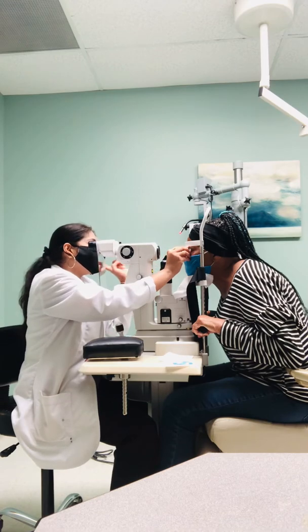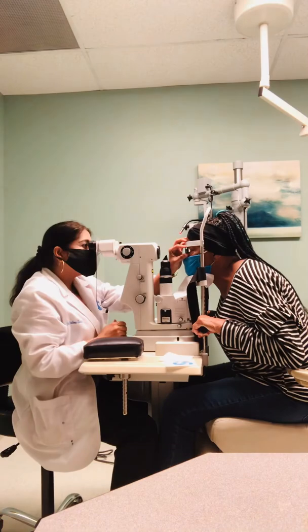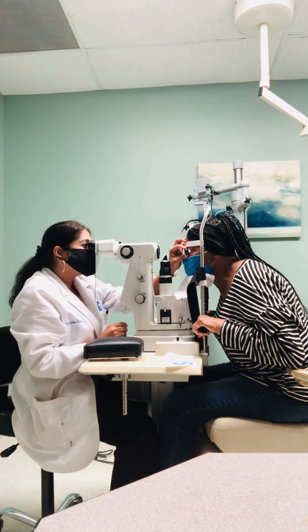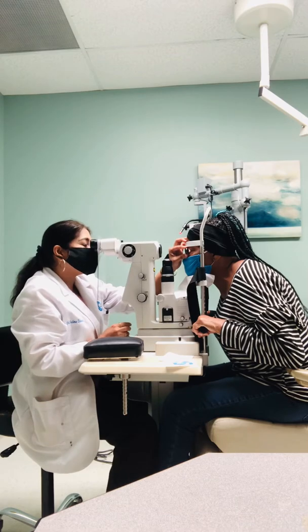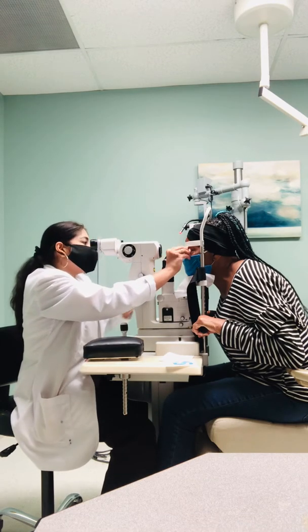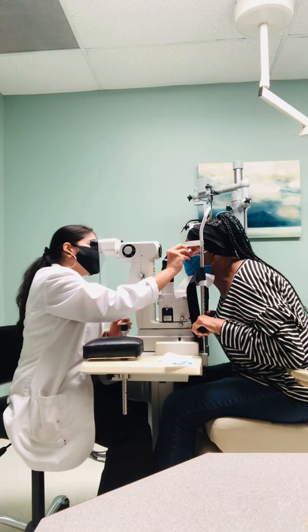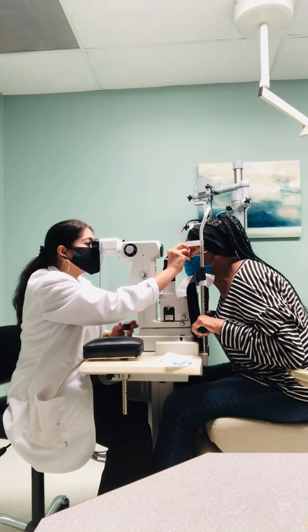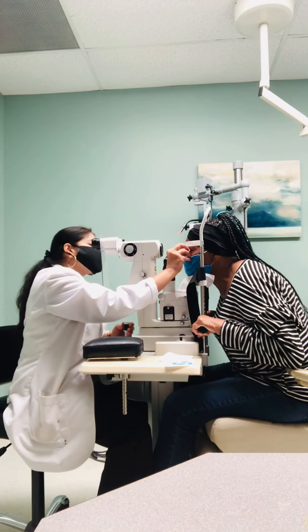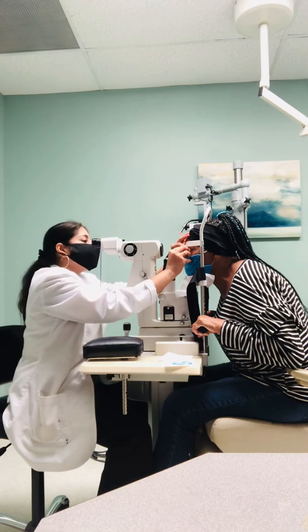Open your eyes now — good, look at me. Bring your forehead closer. As I'm talking to you, you will see how I do it. For narrow angle glaucoma patients, this is a highly recommended procedure because a lot of times the pressure doesn't go down even with the help of drops, so we have to do this. Sometimes this is also considered first-line treatment for narrow angle glaucoma patients.